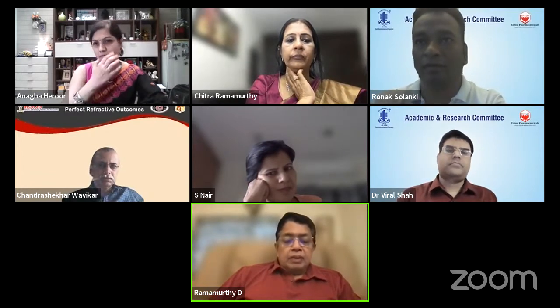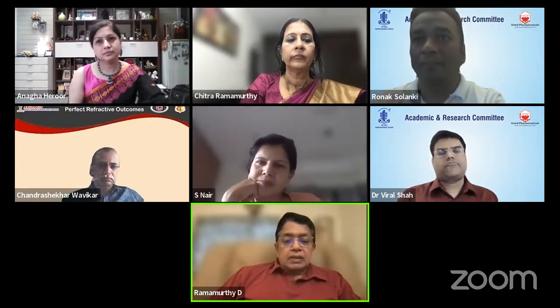Any question to ask from the expert panel, or shall we go on to the last speaker? Just to say, superb surgery, very well documented and very well presented. I was wondering about the SIA, but you gave the answer that it's one diopter. Is it constant? Because some of your colleagues who do a lot of SICS claim that just by the incision, they are able to neutralize the pre-existing astigmatism. They can position and distance the scleral incision. The scleral incision behaves very differently from corneal incisions. So any comments on that?